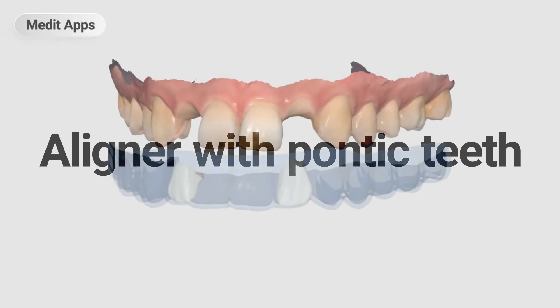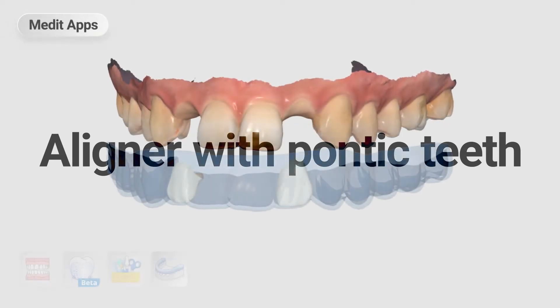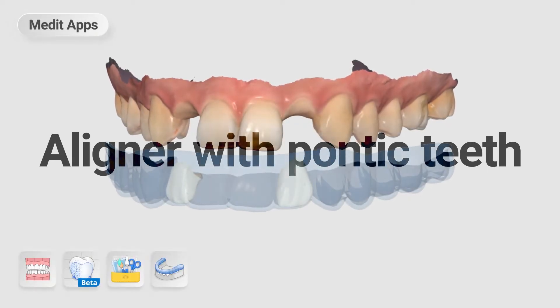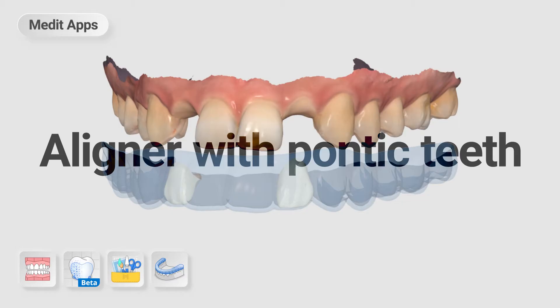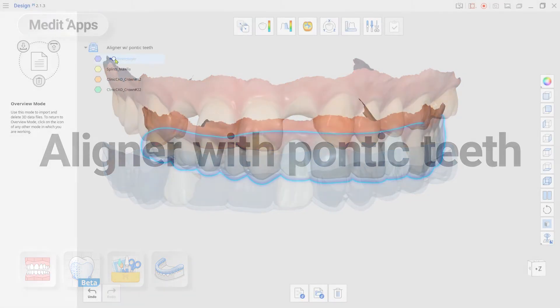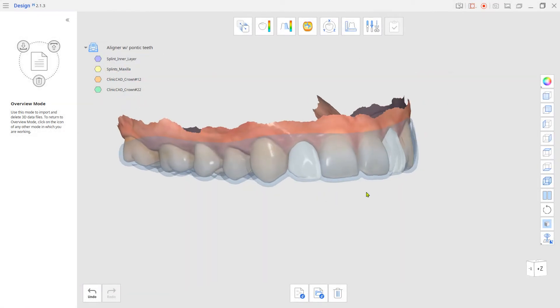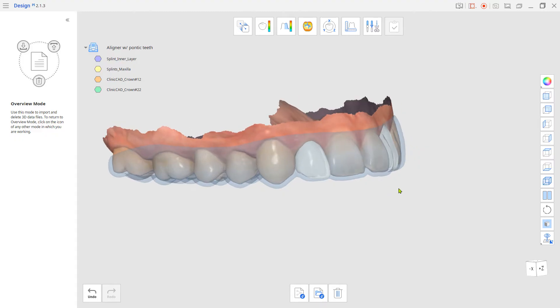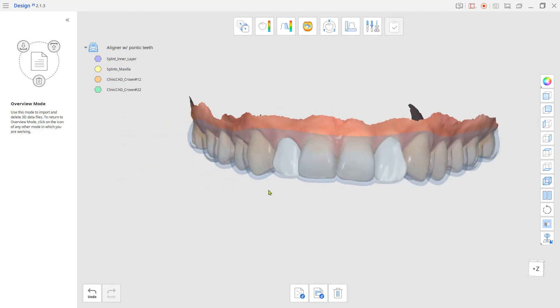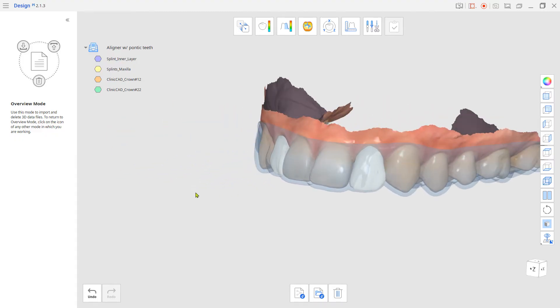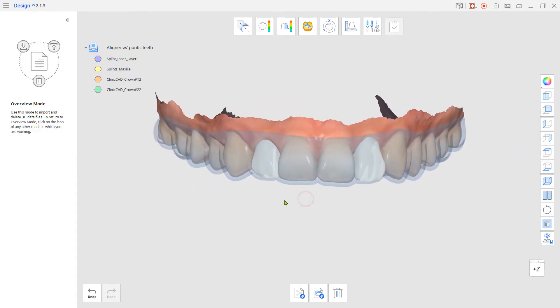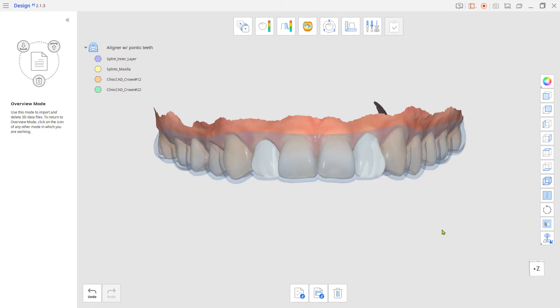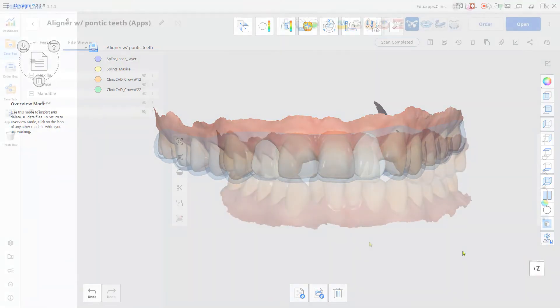This is a quick guide on how to design an aligner with pontic teeth when there are missing teeth. Normally, the orthodontic treatment is carried out by an orthodontist's clinical diagnosis and planning, so this clip only represents designing the aligner with Medit apps.